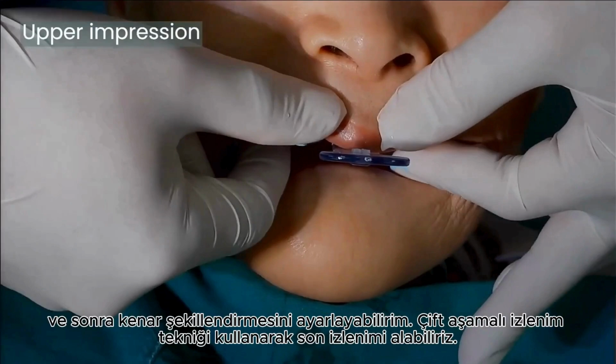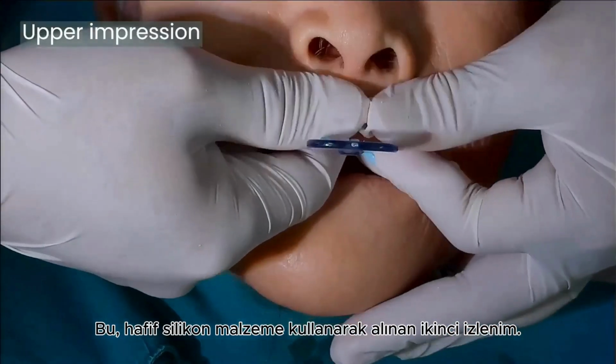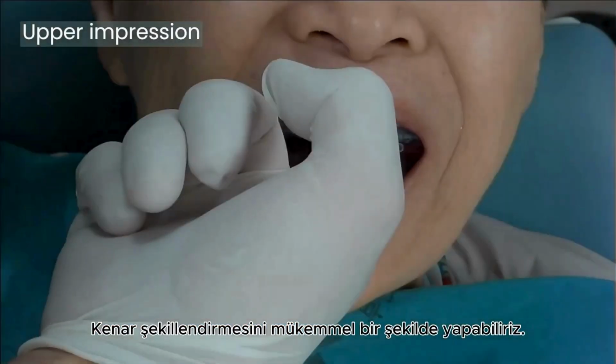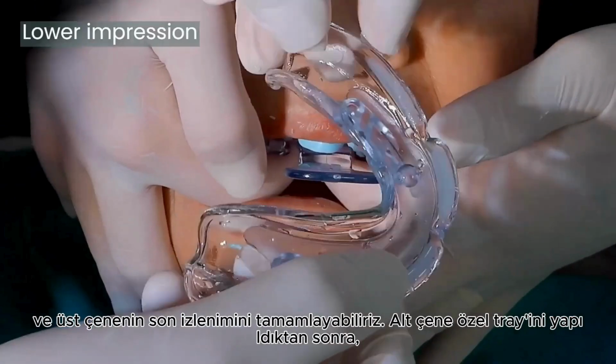I will explain later. This is the second impression using a light body silicone material. We can do border molding perfectly and finish the upper jaw final impression.